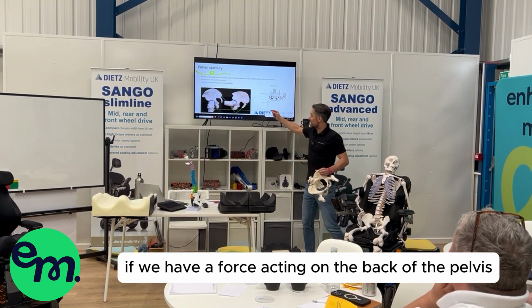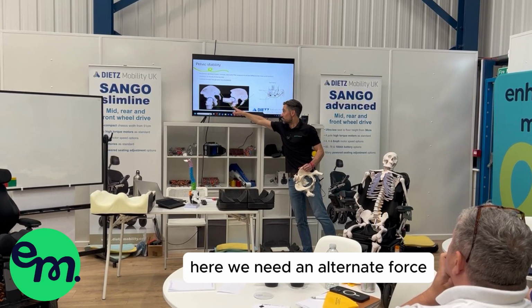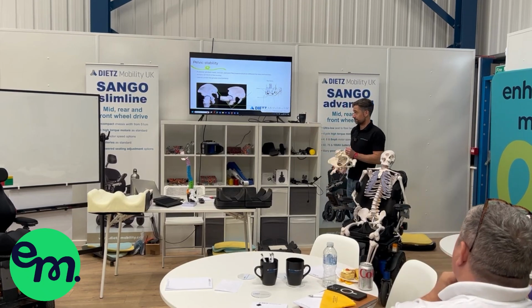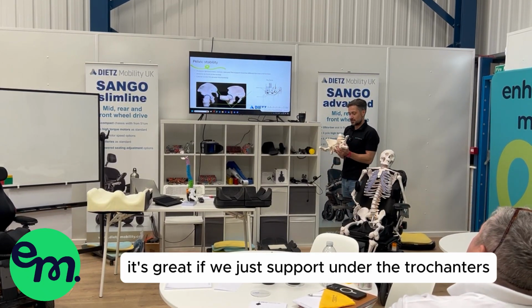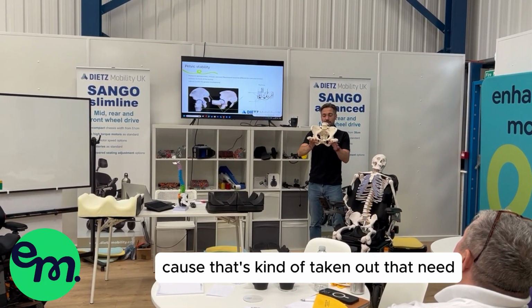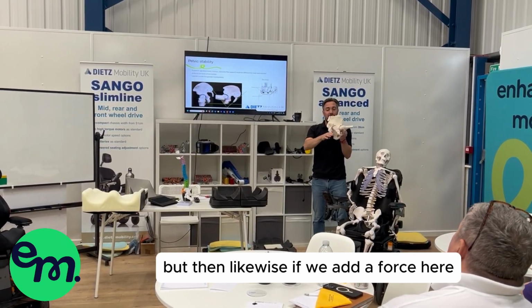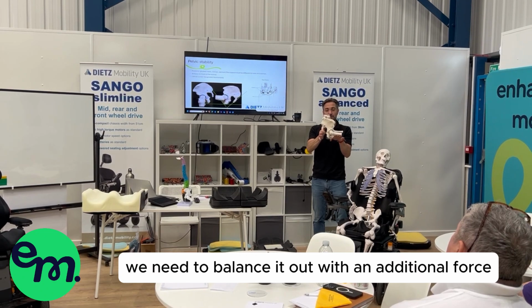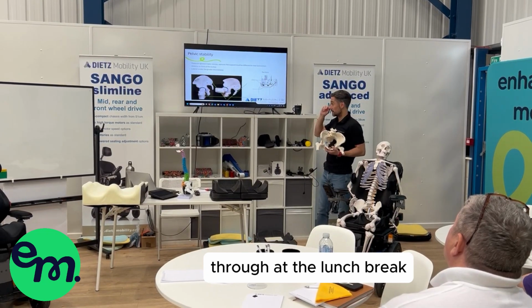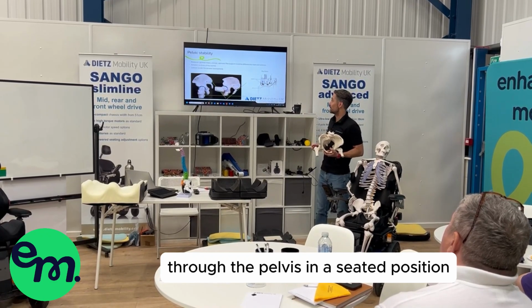That's where, if we have a force acting on the back of the pelvis here, we need an alternate force acting on the pelvis anteriorly to create that stability. Laterally, it's great if we just support under the trochanters, because that takes out that need, or enables that level of stability. Likewise, if we add a force here, we need to balance it out with an additional force anteriorly. That's what we were chatting through at the lunch break. That will help give more stability through the pelvis in a seated position.